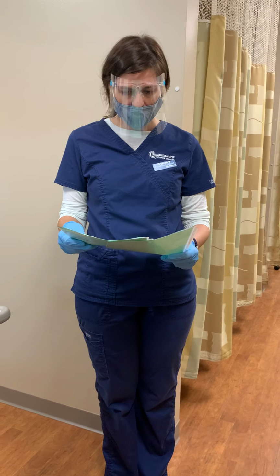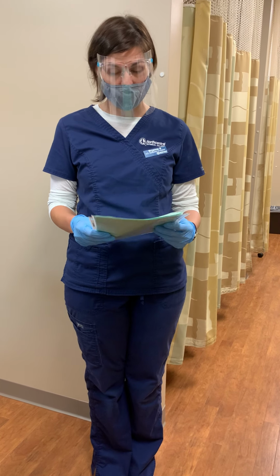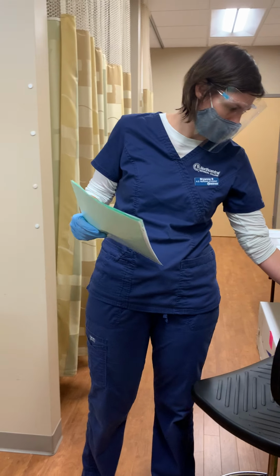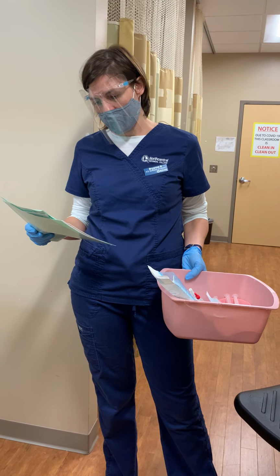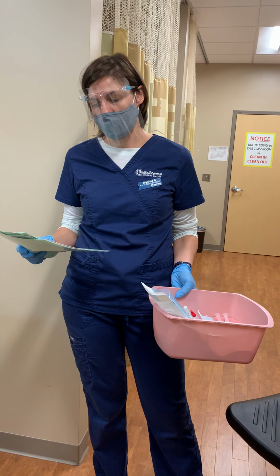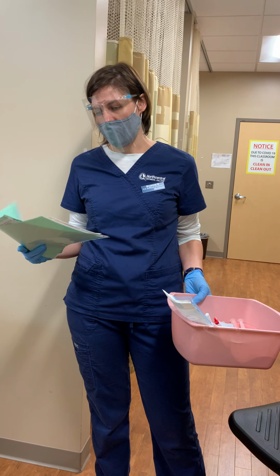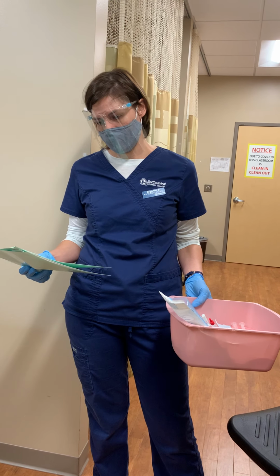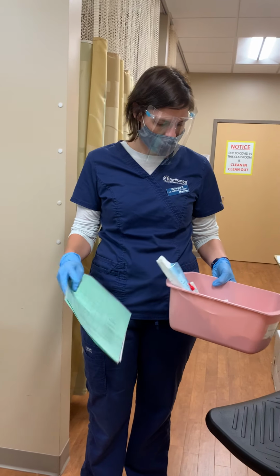So right away I plan on looking at my doctor's orders. I want to start my potassium piggyback that has been ordered. I also noticed that my patient is in pain, so I'm going to give him a morphine IV push. And then that central line change I'm going to do after I've administered the medications and got my patient both stable and comfortable.